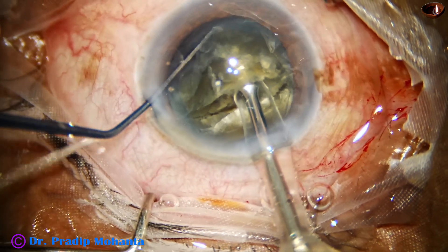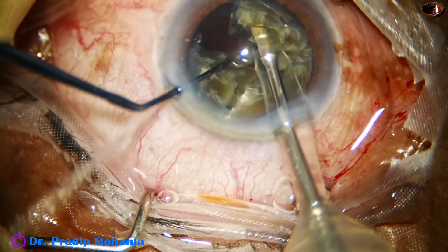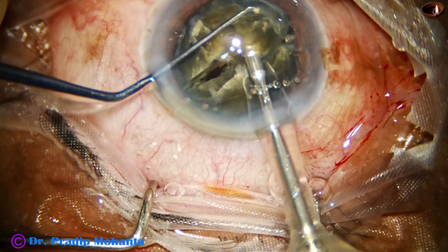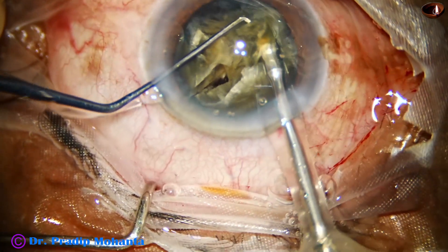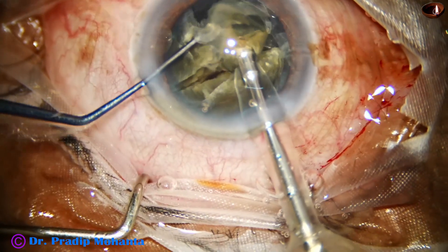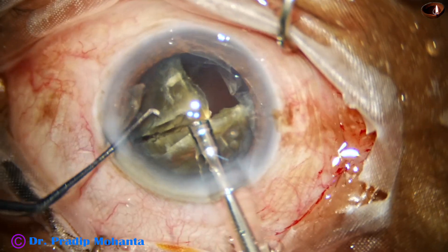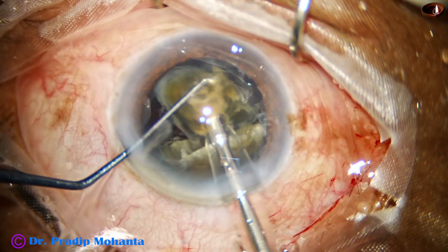By this time, I have made 2 hemi-nuclei, and one hemi-nucleus is being divided into 2 large fragments. I start emulsifying the bases. Again, air bubbles form. The reason I can assume in this case is that the ultrasound was set very high — at 90 percent — and probably it should have been 80 percent. So when I pressed the foot switch, I got more energy than was required.